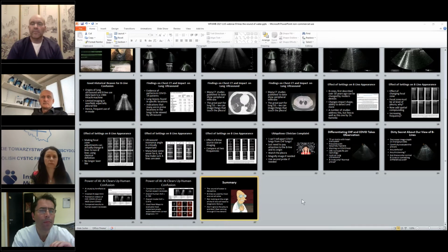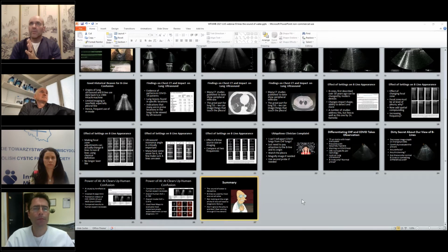Yeah, I think hopefully I caught your question correctly. I do prefer the 12 zone score, basically up to 3 in the zones. That's worked well for me. Just to add on to what you're saying, I think there has to be continuity of documentation between the emergency department and the wards or the ICU, so that there's no confusion about what was seen in the emergency department. And this is where having some sort of system to document images is ideally helpful, but at least the score. And hopefully I answered your question, at least in part.